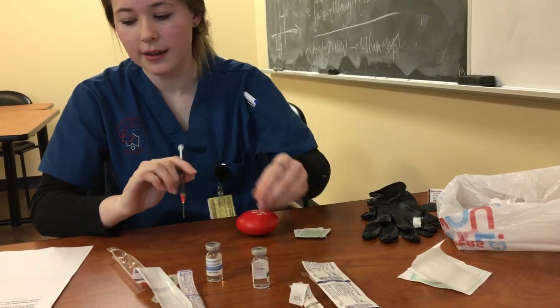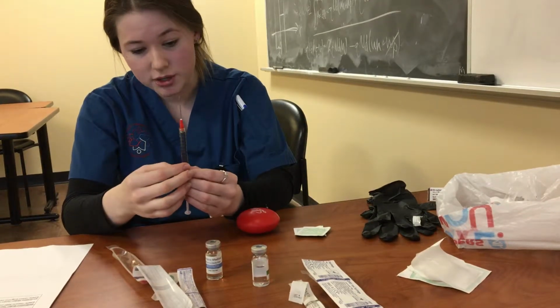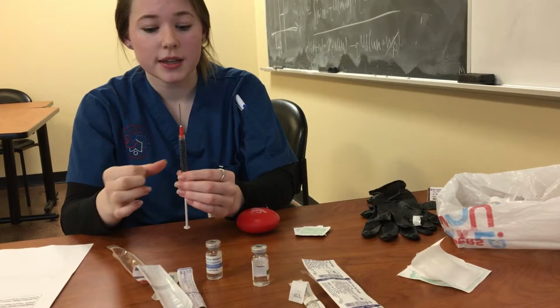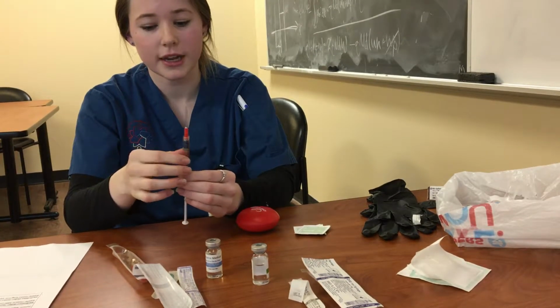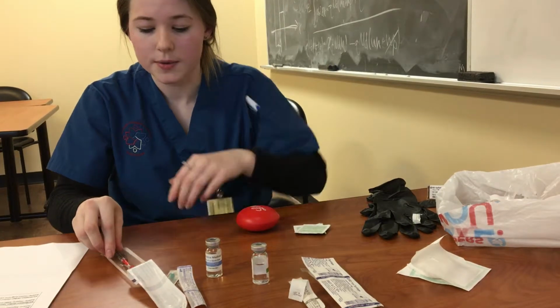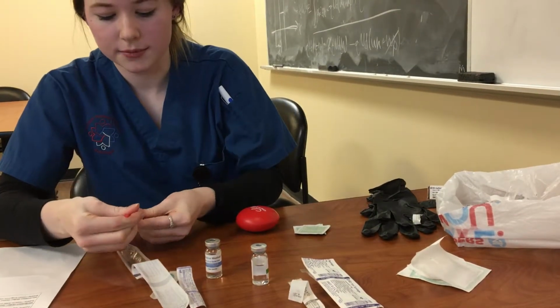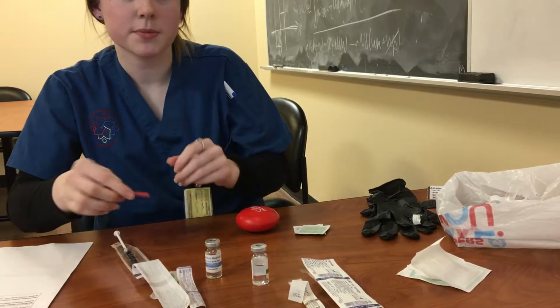Now, because we are giving heparin, we want to be very precise. So I'm going to read on the syringe that we're giving 1 ml. And to get rid of any air bubbles that could be in the syringe, I'm going to give it a little flick. Now that I'm done with the blunt needle, I'm just going to recap it by putting it back into the house of the needle, followed by removing it. And this can go into my sharps container.